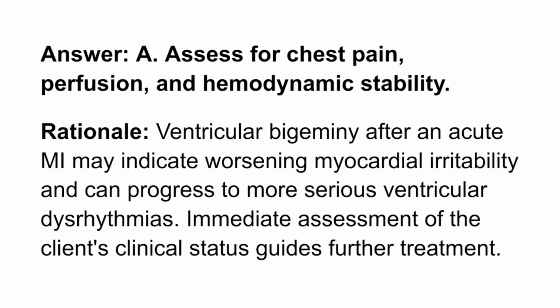Rationale: Ventricular bigeminy after an acute MI may indicate worsening myocardial irritability and can progress to more serious ventricular dysrhythmias. Immediate assessment of the client's clinical status guides further treatment.